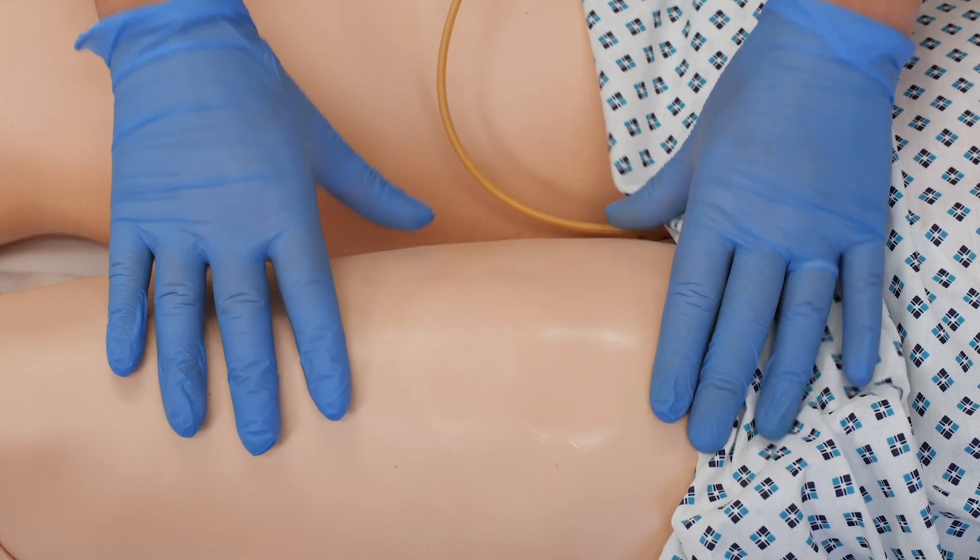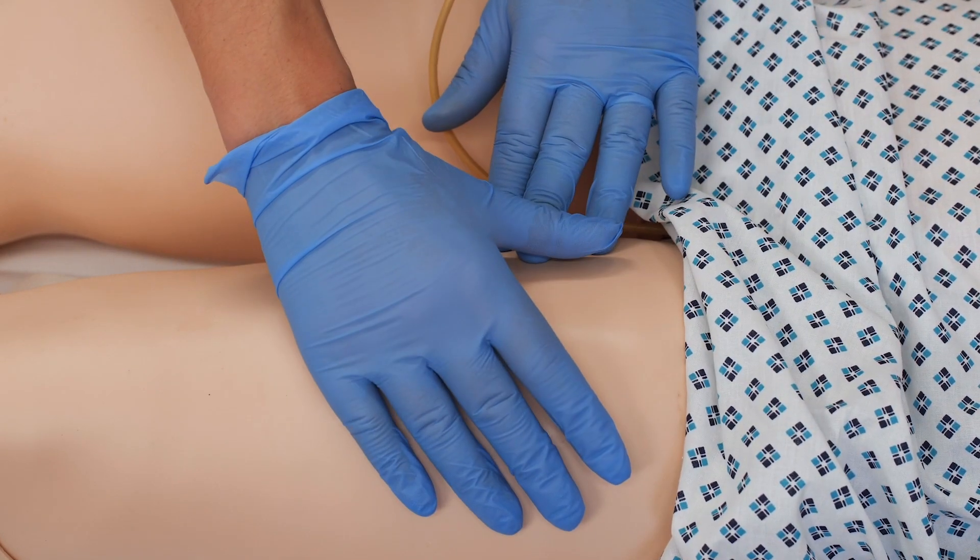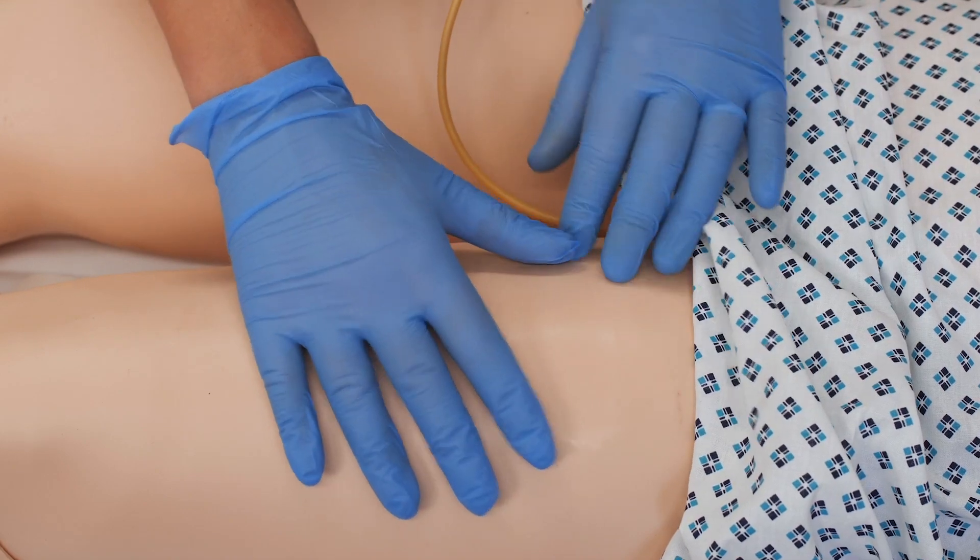Once removed, do a visual check of the leg and have a look at the skin again, and hopefully no damage will have been caused.